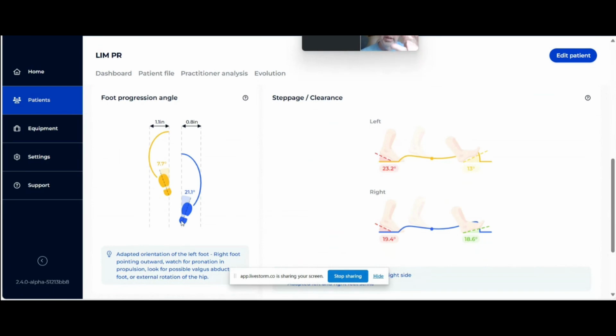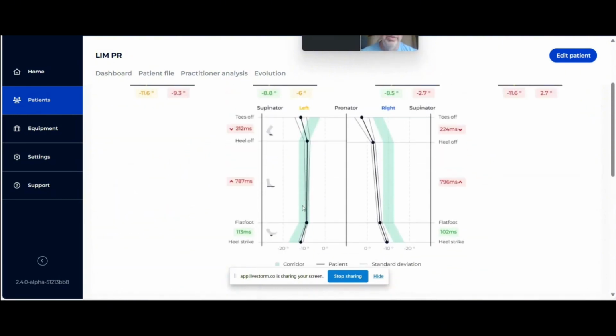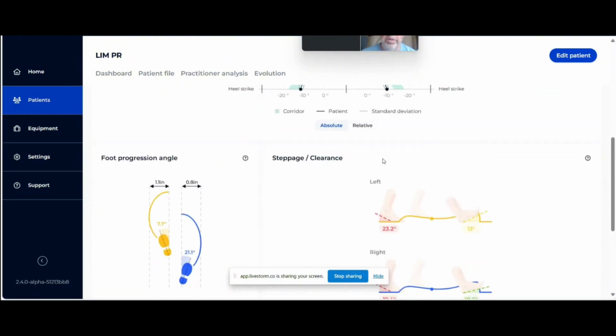So, slightly breaking the midline, going to the outside a little bit. So she's way beyond, especially on that right foot. And we see that that's one of the reasons that she lands with the heel. So that foot is going to be abducted, and that causes her to rotate. So she doesn't really have good trajectory or position for that foot to be able to have a really good toe off or get back into classic supination with regards to that toe off position.